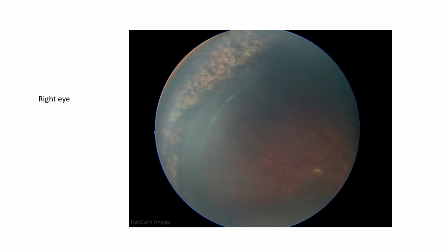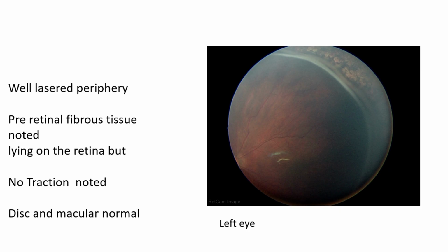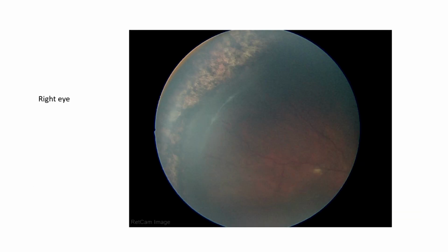Yeah. So you see this, this is the right eye, and do you see vessels beyond this? Go back. We're still not finished. You see these vessels, and it's actually very faint, but there are vessels beyond that. So vessels are not jumping this ridge and going. The vessels are going from the base of the ridge anteriorly. The ones which are jumping and going are not retinal vessels. They are new vessels. The vessels which are going through the ridge or beyond the ridge are normal retinal vessels. All right. So we have to differentiate between the two.